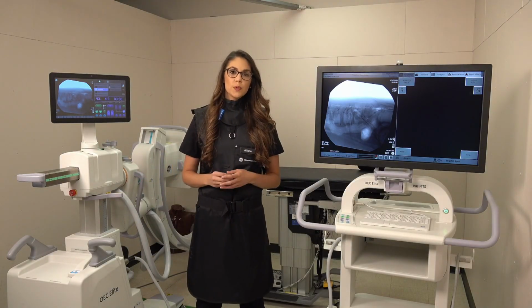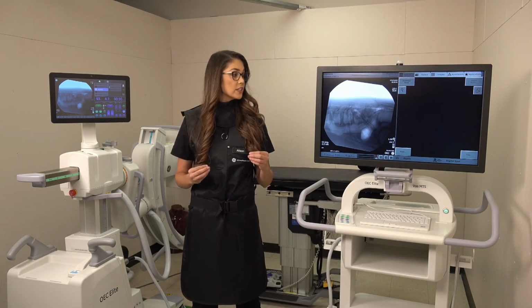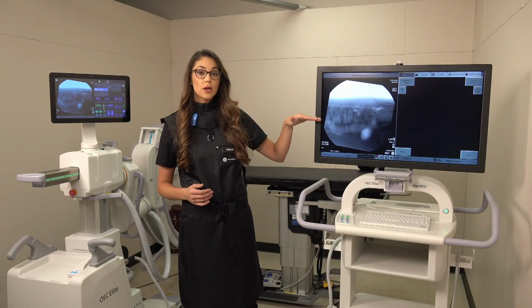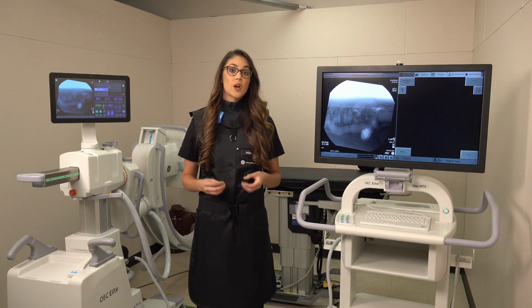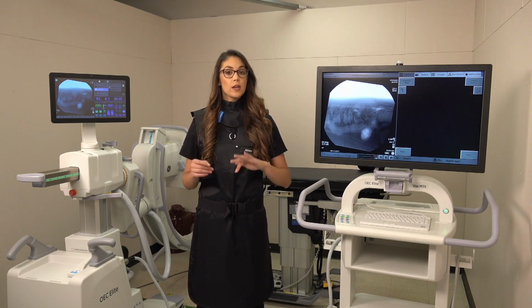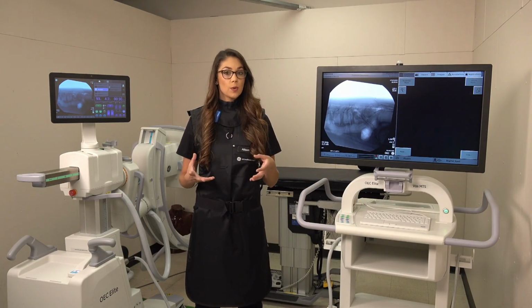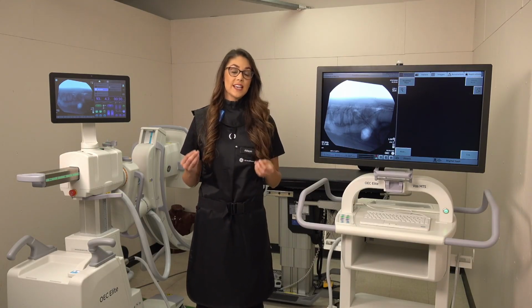A couple of cases where we really see the benefits of utilizing collimation primarily surround lateral spine imaging. Of course, here with the lumbar spine, it's great to remove the air. We can also utilize our iris collimation when we're imaging C7. That way you're removing the areas of lesser density so that you have better image quality. And again, utilizing your collimators reduces scatter radiation.